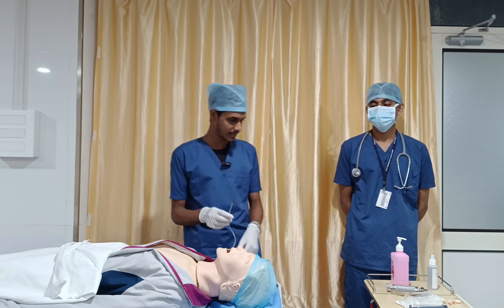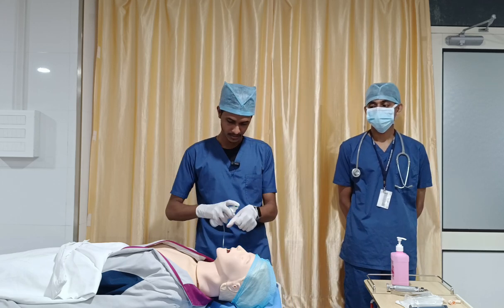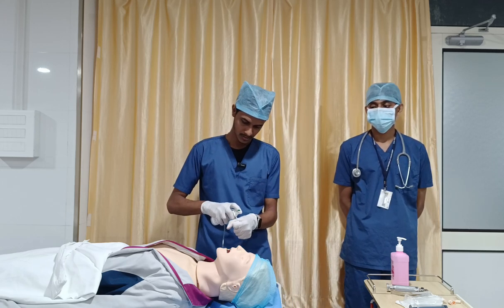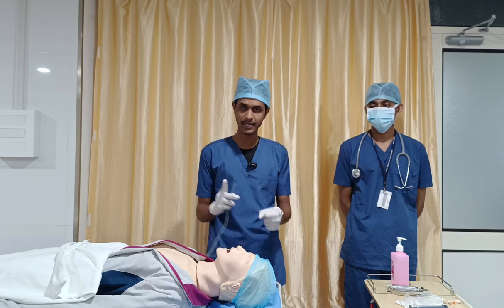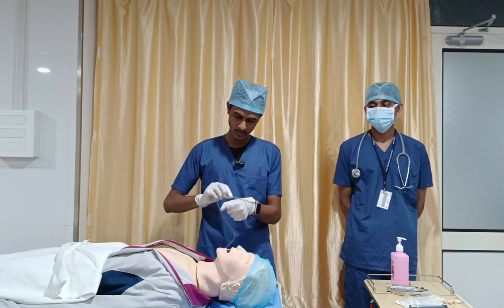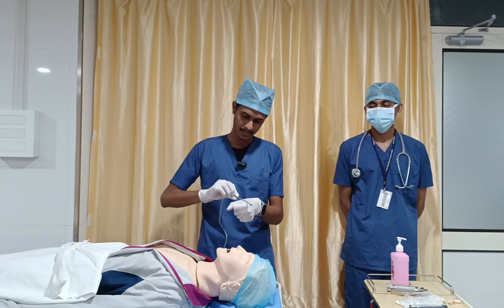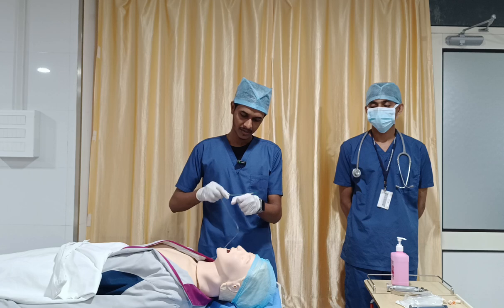So I remove the catheter and then I have to apply the lubricant gel. Ideally here you have to use lignocaine gel. You have to apply it all over the catheter, almost half of the catheter, you have to swipe like this.